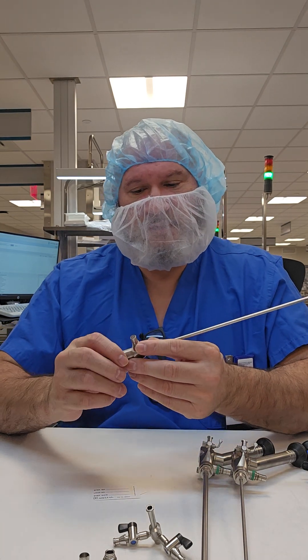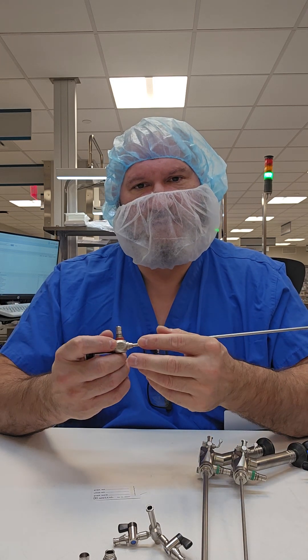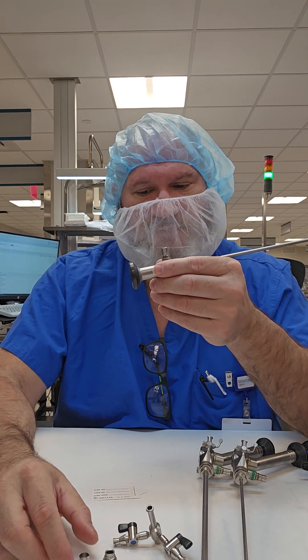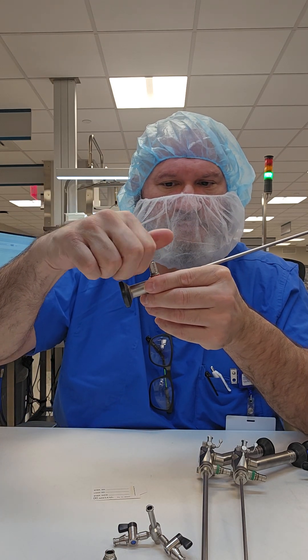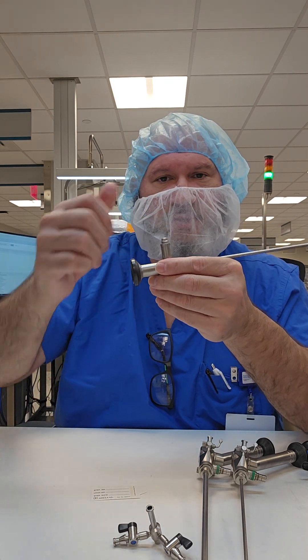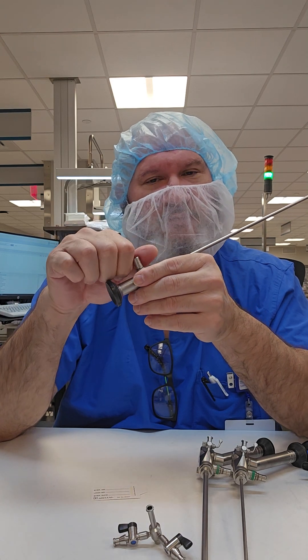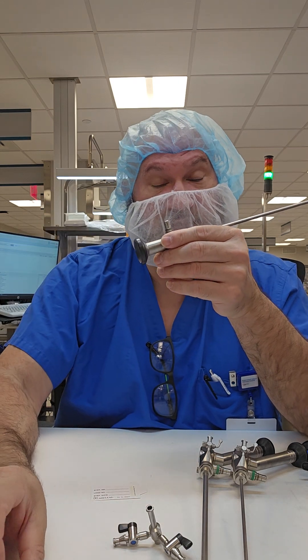Another important point about rigid endoscopes: as the name implies, they should not be bent. There should be no flexion, no bends whatsoever. The light post has accessories that may be used at point of use — including a small light adapter and a large light adapter that screw on. If scopes come back with these adapters attached, they should be removed. If processed with them on, they can become difficult to remove, so make sure you're only removing what is meant to come off.